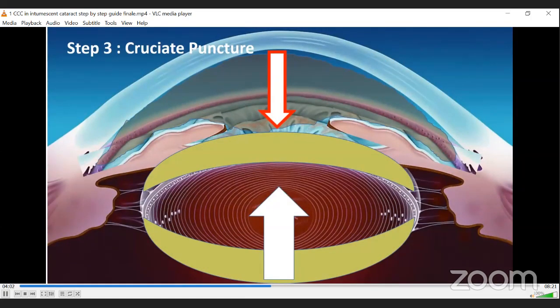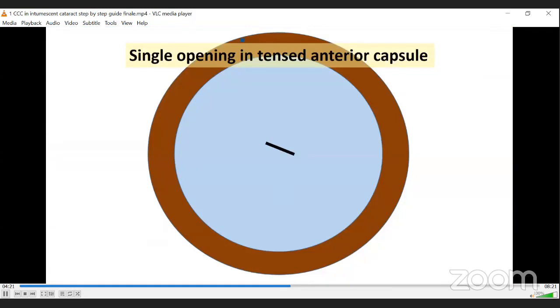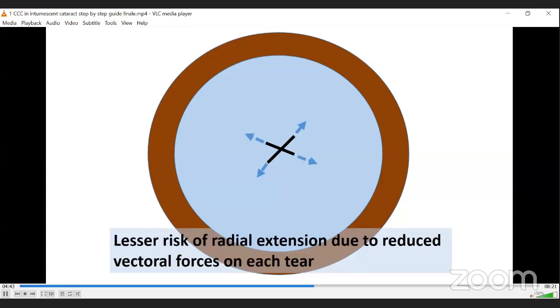The third step is making a cruciate puncture. The simple principle behind this is that because you have made a cruciate puncture, 4 different tears are there. Whatever intralenticular pressure is there is not going to act on a single tear. So the chances of it extending to the periphery are less. If you make a single tear, there is a high risk of extension. So you can make a cruciate. Some surgeons use a C kind of tear, which is also okay. But I think cruciate makes more sense because there is a lesser risk of radial extension.